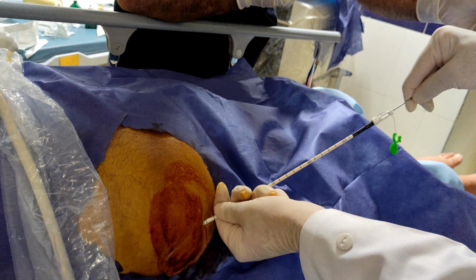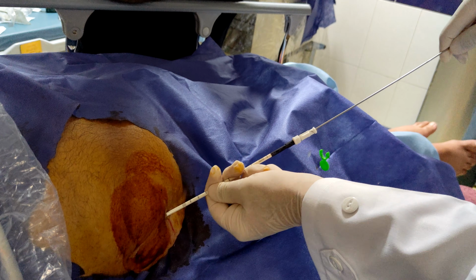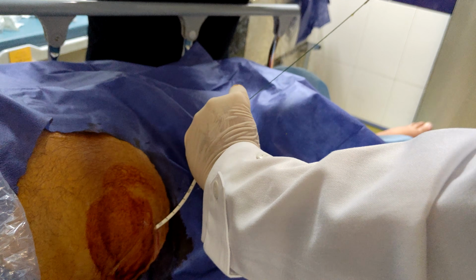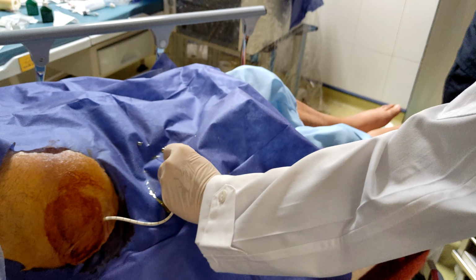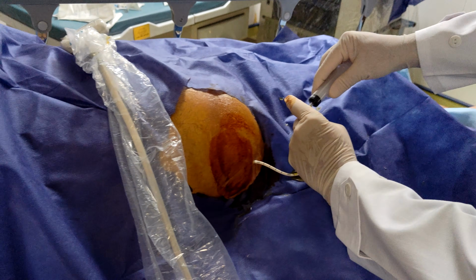After the placement of the catheter, the guide wire is removed. We confirm the correct positioning of the catheter by seeing free fluid in the cavity.